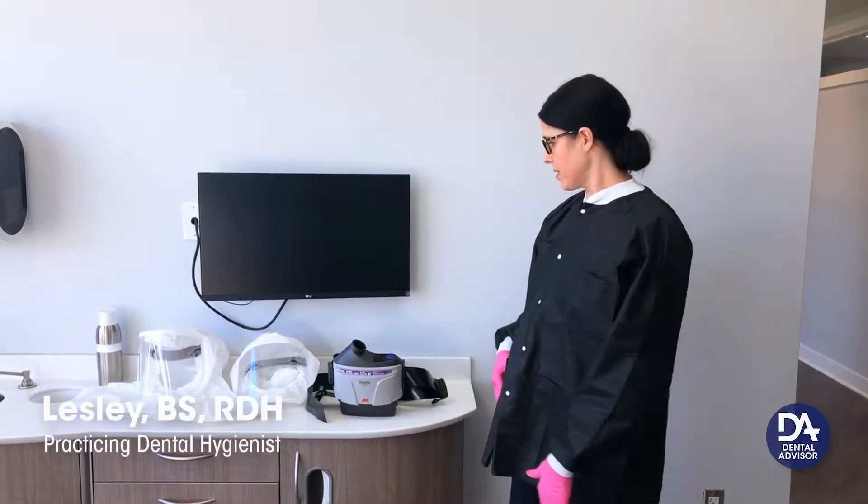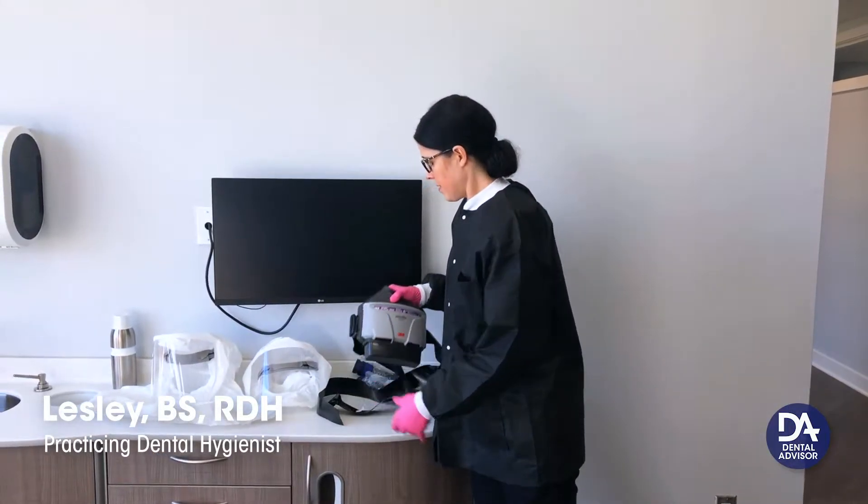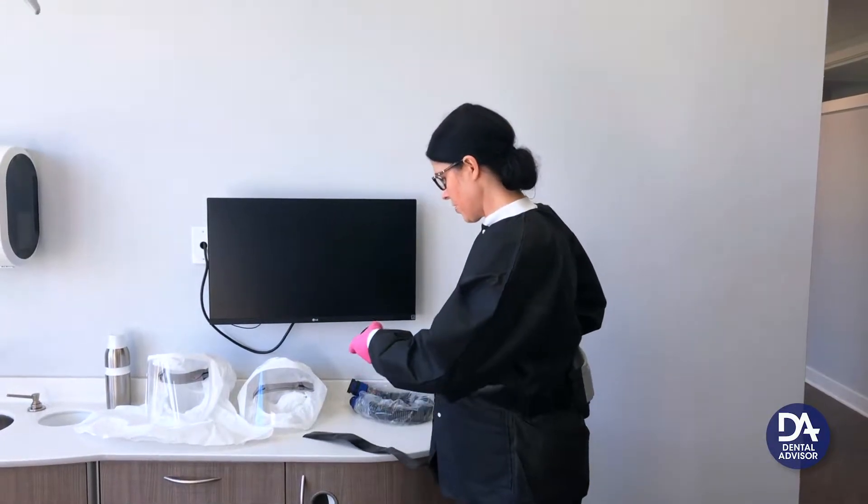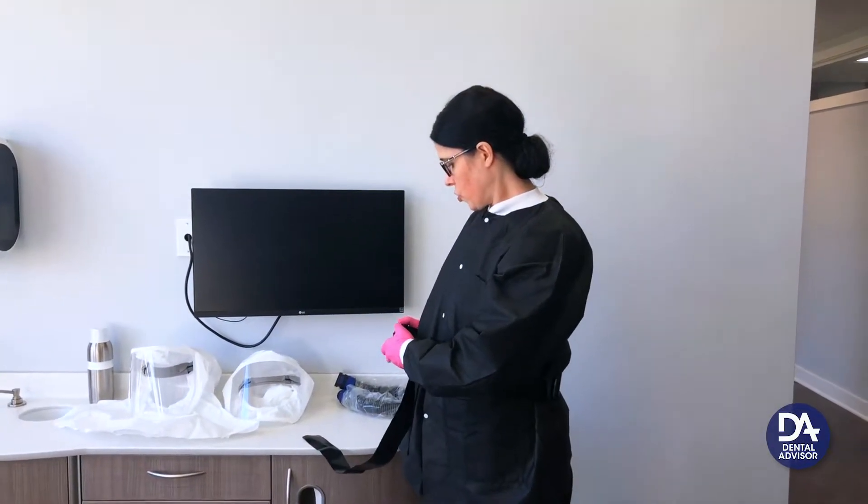I'm going to show you how to put on and attach the device. The simplest way to do it would be to put the pack behind your back and attach the belt buckle towards the front.